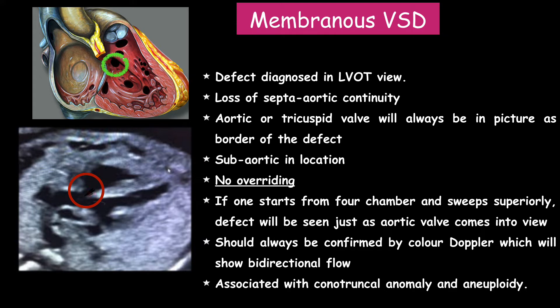If one starts from the four-chamber view and sweeps superiorly, the defect will be seen just as the aortic valve comes into view — this is the five-chamber view. This should always be confirmed by color Doppler, which will show bidirectional flow. This membranous VSD is commonly associated with conotruncal anomaly or aneuploidy.